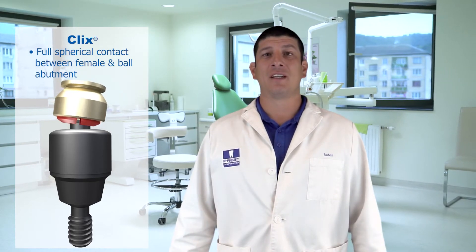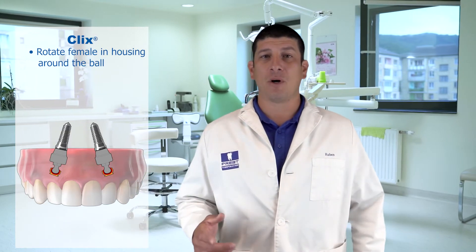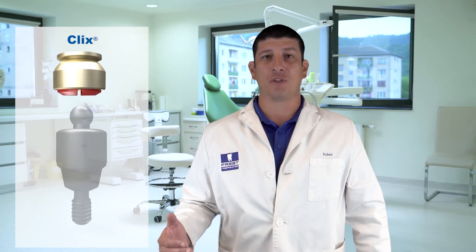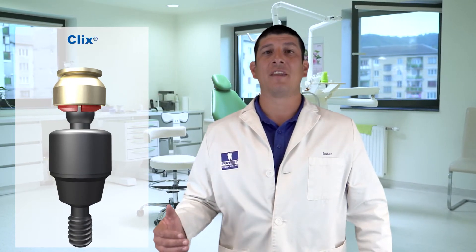Also unique to Clix is the ability to rotate the female housing around the ball. If you have implants that are divergent, the Clix Ball Abutment can correct up to 30 degrees. Simply rotate the housing of the off-angle implant back to the path of insertion. This also allows one path of insertion for the prosthesis as the patient inserts it, making it easy for them — they hear that audible click and have the confidence.